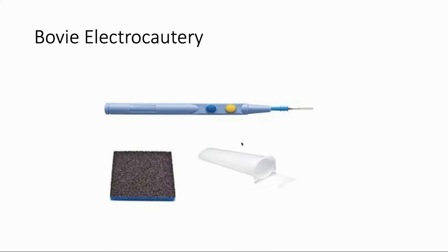Here's the Bovie electrocautery. It's essentially a thermal device that uses energy to coagulate and cut through tissues. It usually has two options — one for cut and one for coagulation. The heat is at the metal end, and we'll frequently just refer to this by the first name, Bovie.